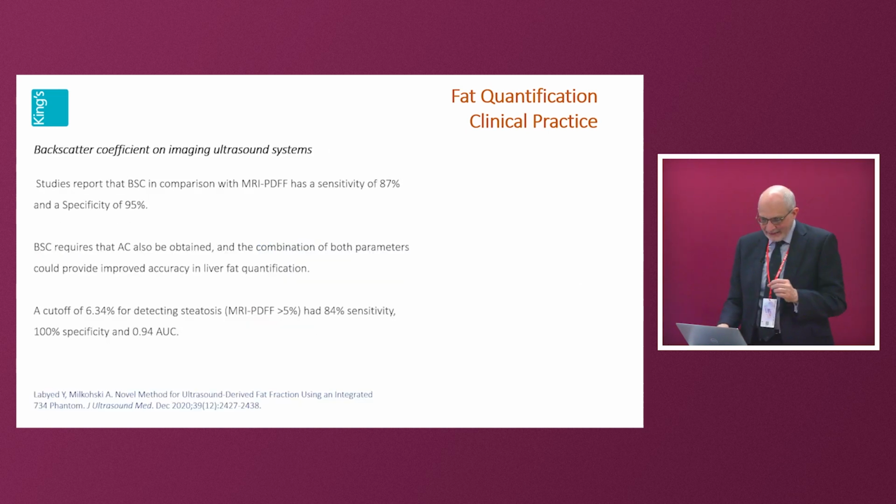Backscatter, there's less information out there, but it seems to have a little bit higher sensitivity and specificity in some of the studies done. So watch this space with backscatter, and certainly with the study we're doing at the moment, backscatter does reasonably well against attenuation and sometimes outperforms attenuation. So backscatter may also be useful, but what about combining the two, as people have done? Combine the two, make the most of it.